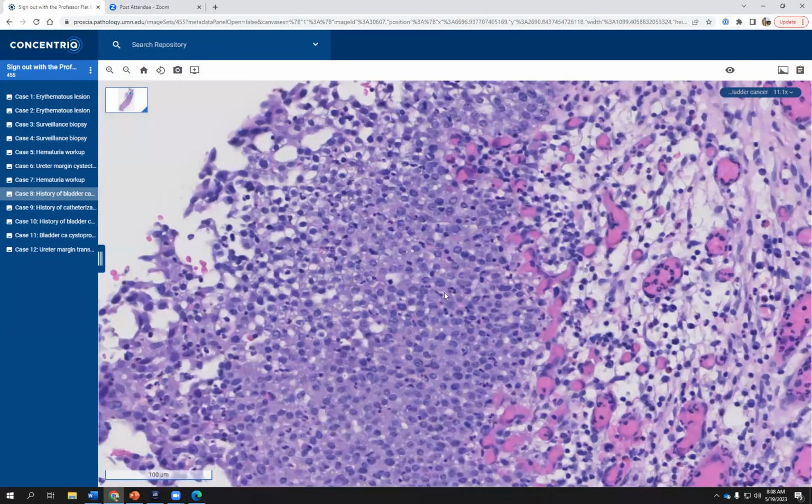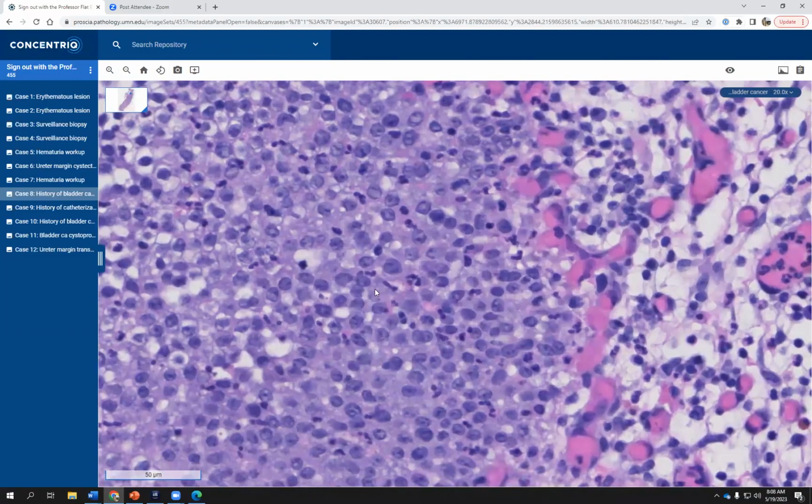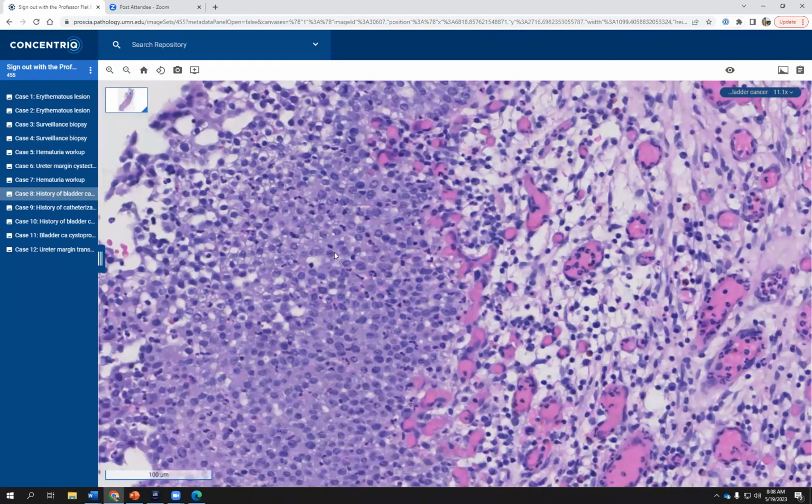And then if you compare the size of these nuclei to the size of the lymphocytes, another useful feature that we saw earlier, like for example, there's a lymphocyte over here and there's a nucleus over here. So maybe it's twice the size of the lymphocyte, but not more than 3 times. So in most situations, this is a very helpful feature.